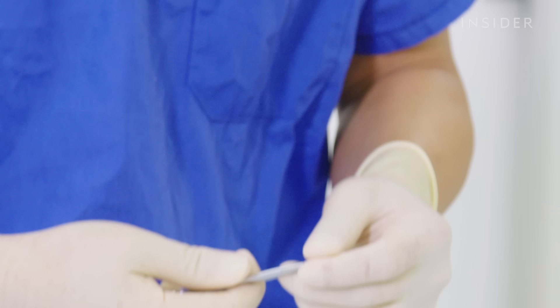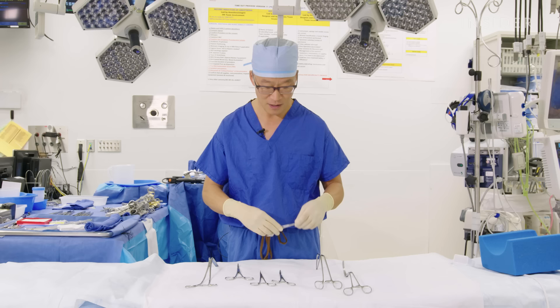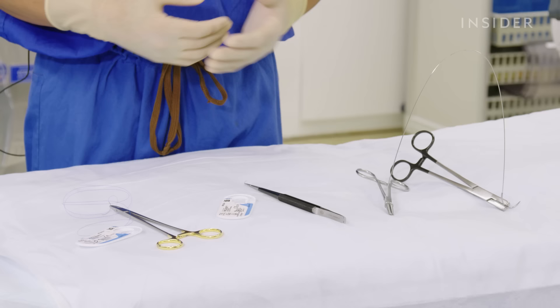These are other wide ranges of clamps going as small as this — we refer to this as a mosquito, which is a very small clamp that can clamp very, very small blood vessels. All these clamps are used to hold things, whether it's tissue or sutures, to allow us to proceed with the operation.